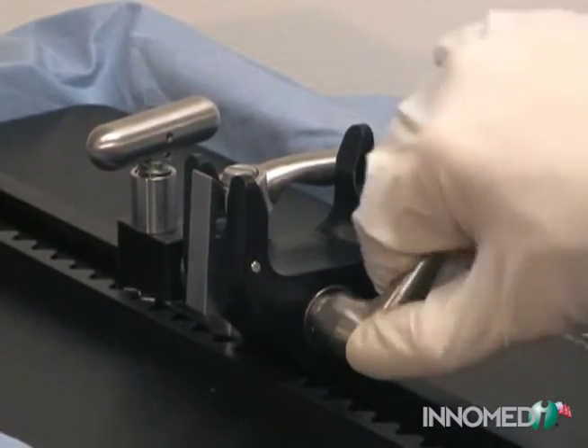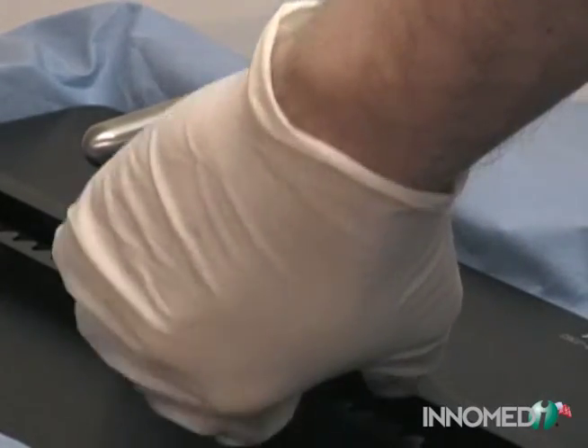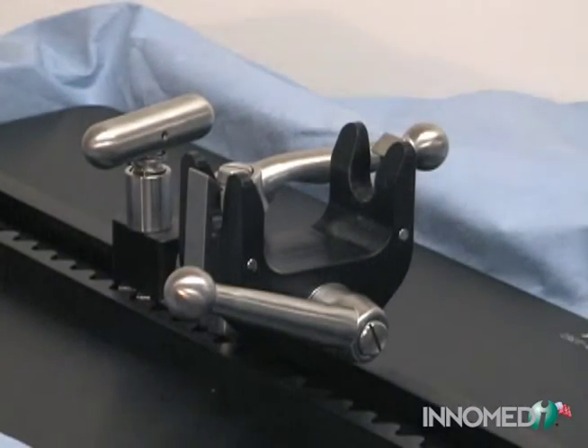The tilt and rotation bars can be modified for access by lifting upwards and changing the handle position.